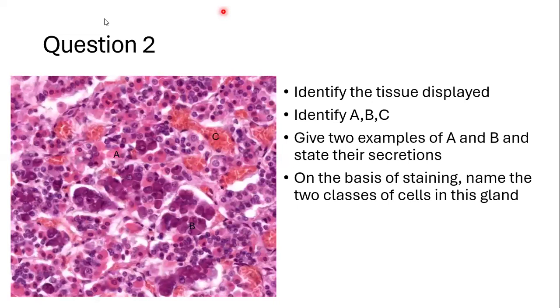For those who said adenohypophysis, it is actually adenohypophysis. This is just a higher magnification of the adenohypophysis. You can see we have some purple cells, others are pink. A is pink, B are somewhat purple, and other cells are not taking up stain. The pink and the purple ones are the chromophiles, whereas the clear ones, which are not taking up the stains, are the chromophobes.